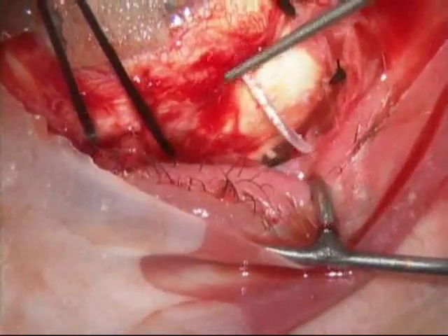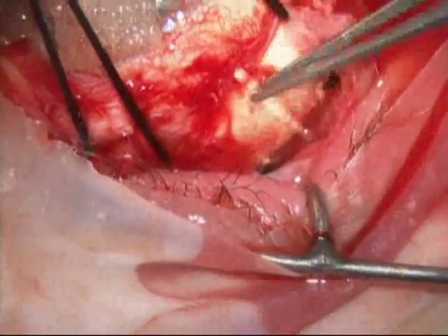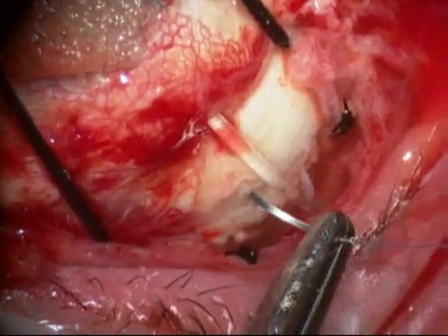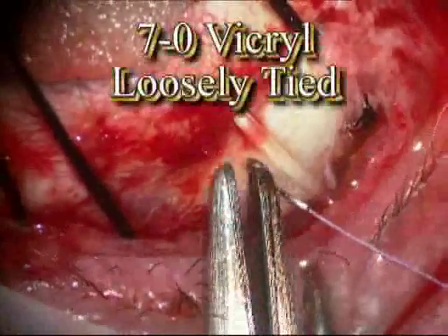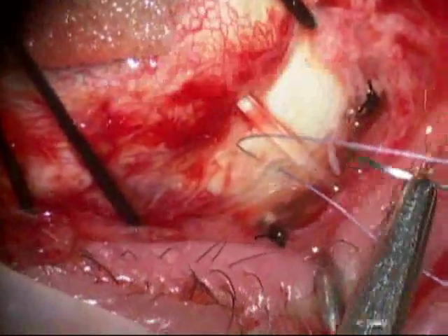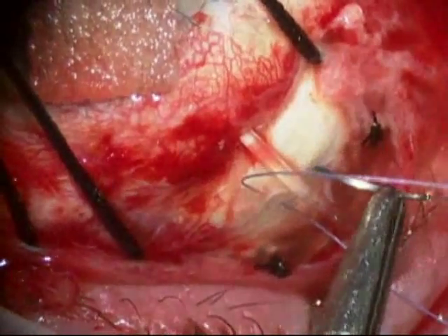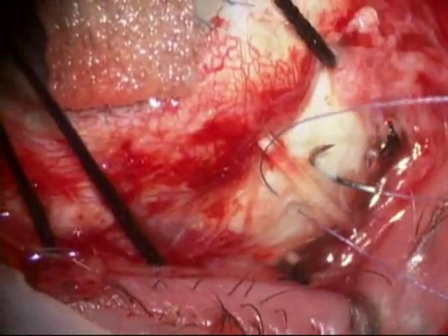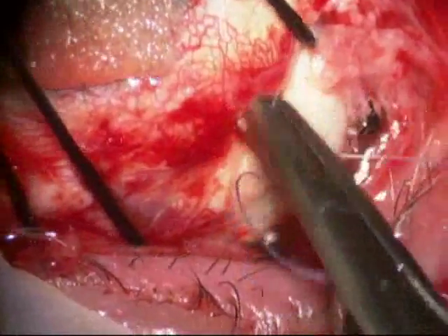This particular patient has also had a previous vitrectomy. The vitreous is clear, so the AMED valve can safely be placed posteriorly without worrying about the tube being clogged by vitreous. It's also a little safer for the corneal transplant to place the valve posteriorly — that way the tube doesn't rub against the cornea and cause problems with later corneal decompensation.